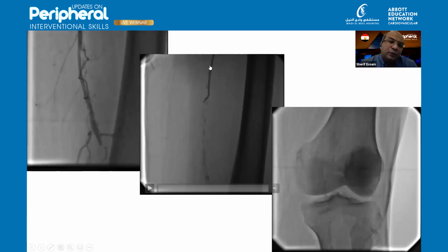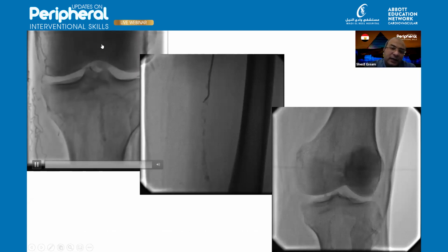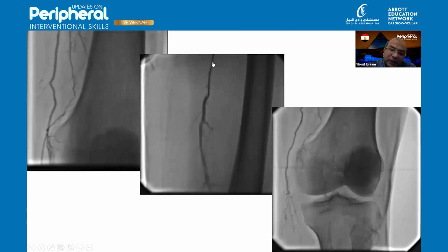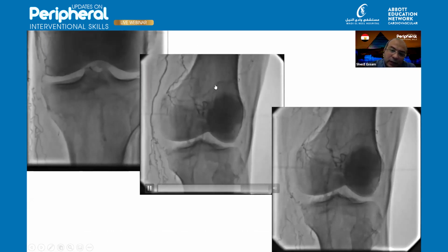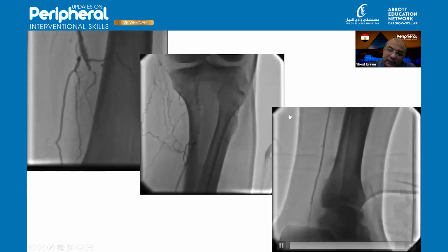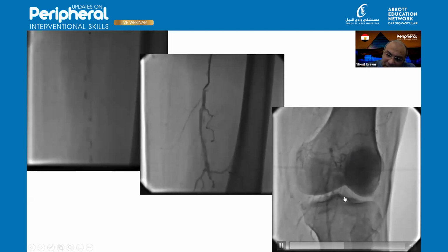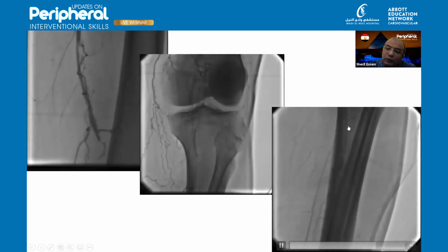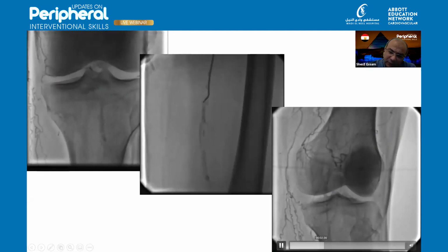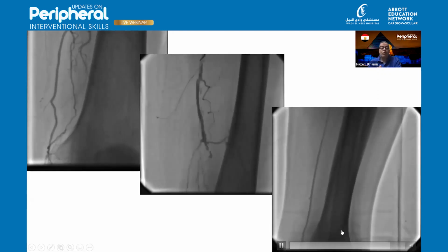So further down, we took another angio, and that's the occluded SFA at the Hunter's canal, and the occluded popliteal artery. That's a direct injection showing the occluded SFA at Hunter's canal and the popliteal artery as well. And that is the very faint runoff. You can see in here very faint refilling of the P2 segment, continuing down P2, P3, and posterior tibial.